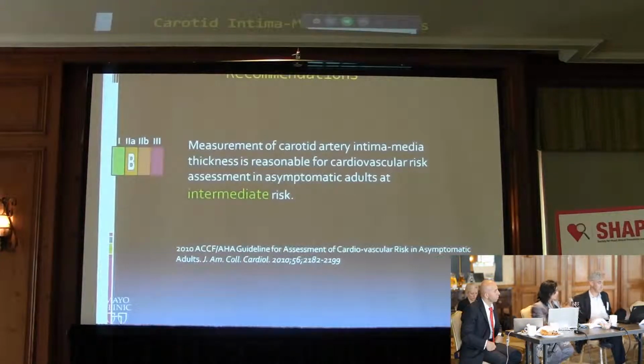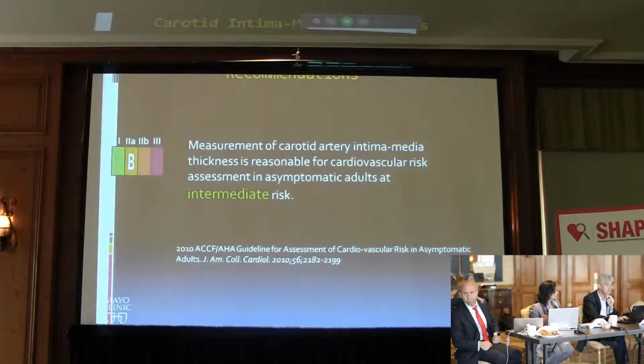I agree. And again, the other question would be how reproducible it is. I mean, how many people can actually do it? To whom would that technology be available? This is a technology that's available in every center that can do vascular ultrasound. So it's something that has actually been done many years ago, which is the Balsero study I just showed you.